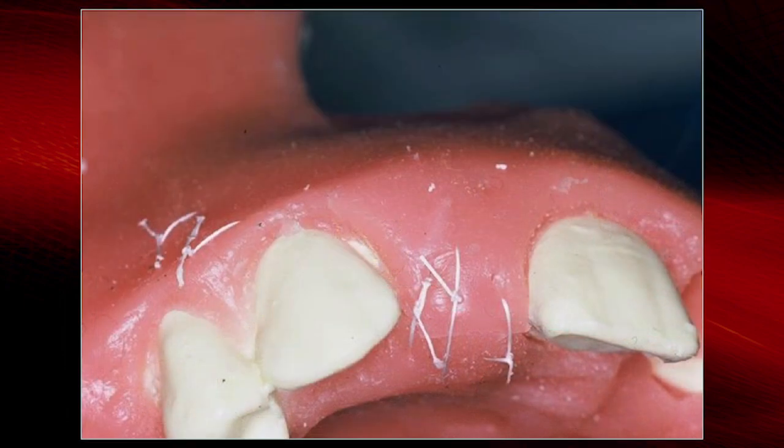So then we can make our closure, our interrupted. We want to do our obliques first and then the horizontal next. And then if we go to uncover, we can come in with this U-shaped incision here, or we can come back to this and here. It really doesn't make a lot of difference. But the main thing is you're keeping this tissue up to there.